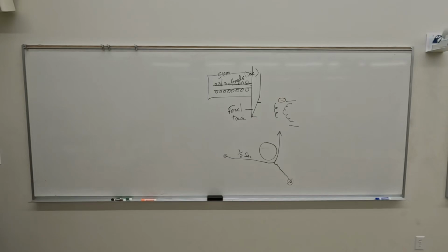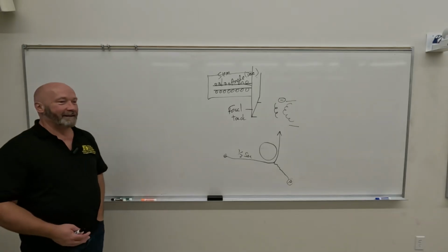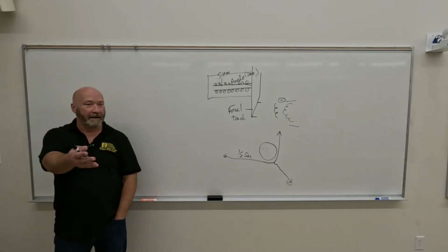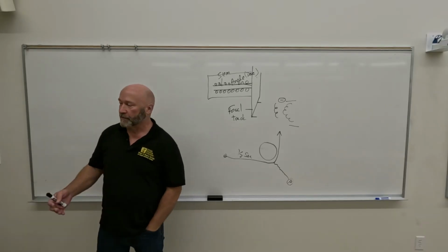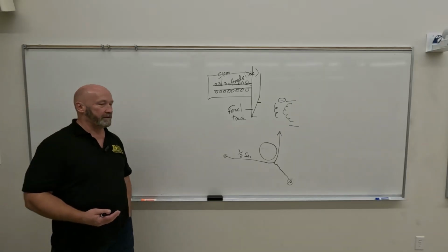So we've got 3,400 degrees Celsius. We do Fahrenheit here, right? So what is that in Fahrenheit? It's a lot more than 3,400, right? So 3,400 degrees Celsius is the melting point. So is it going to melt on a single exposure?